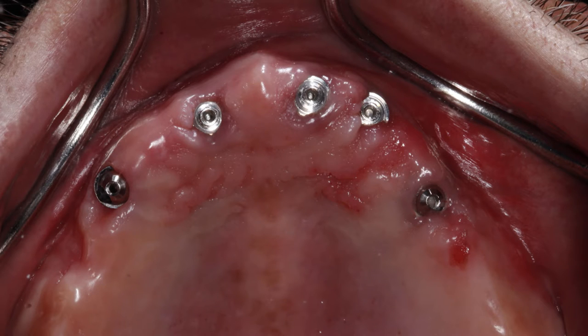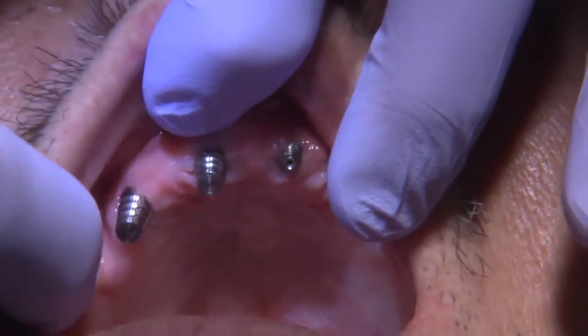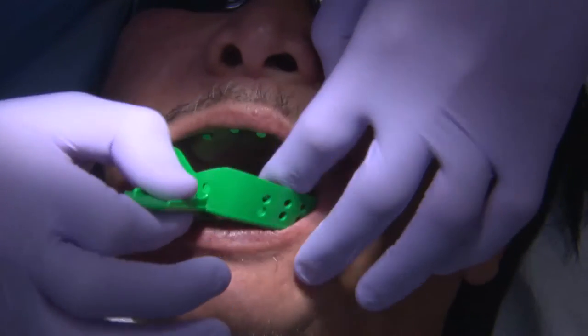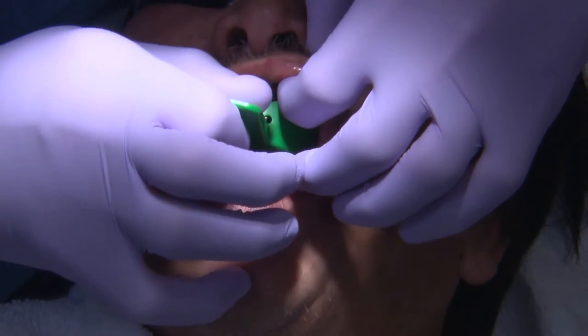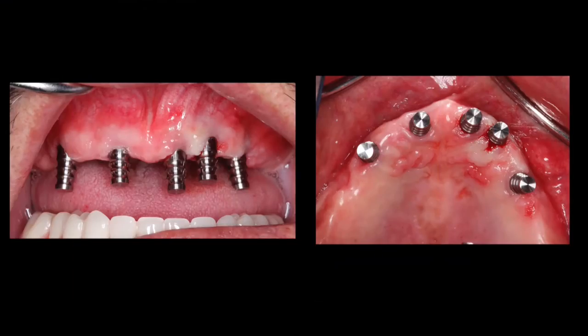We were lucky enough to be able to place our impression copings. These are preliminary impression copings for a closed impression tray technique, just so we have an approximate distance between our implants, and we can request the laboratory to fabricate an implant verification jig.